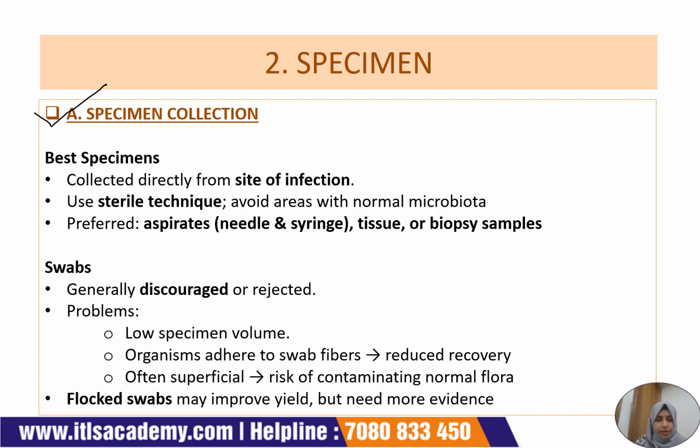The best specimens are selected based on these three qualities that involve collection of the specimen directly from the site of the infection.